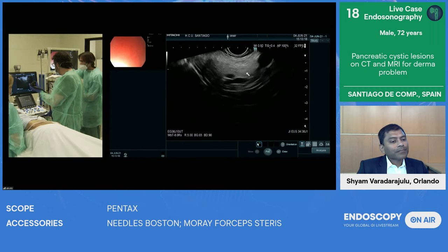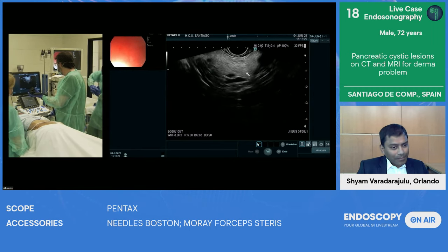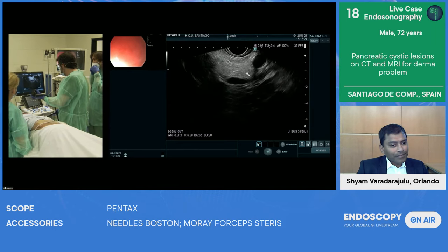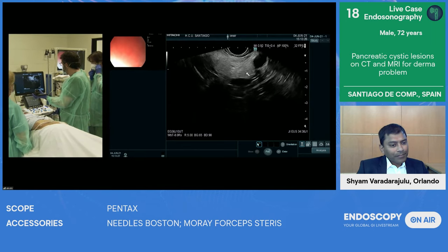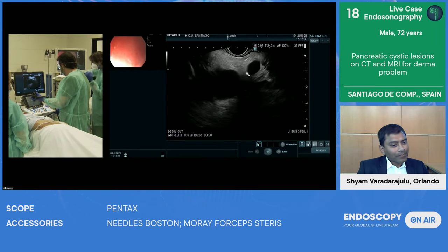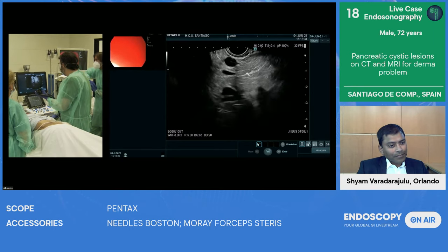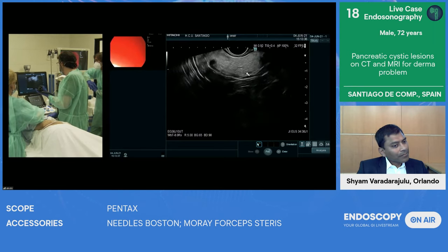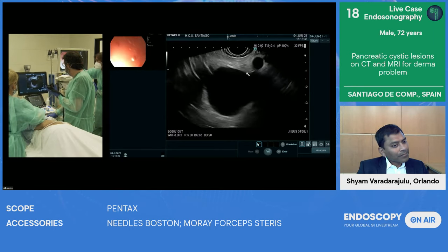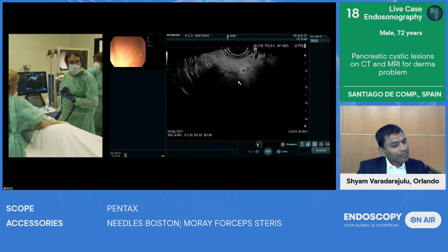But we are just now in the pancreatic body. We have the splenic vein and the splenic artery. So now I am just pulling back the scope. As Jose just commented, this is a fat infiltration, but no signs of chronic pancreatitis. And here, this is probably the most important. So let me change my position a little bit because this is probably the most important lesion. Here we can see, this is a big lesion.